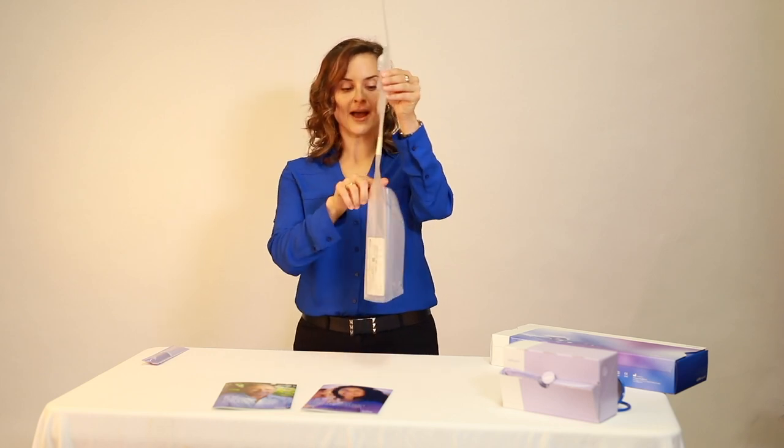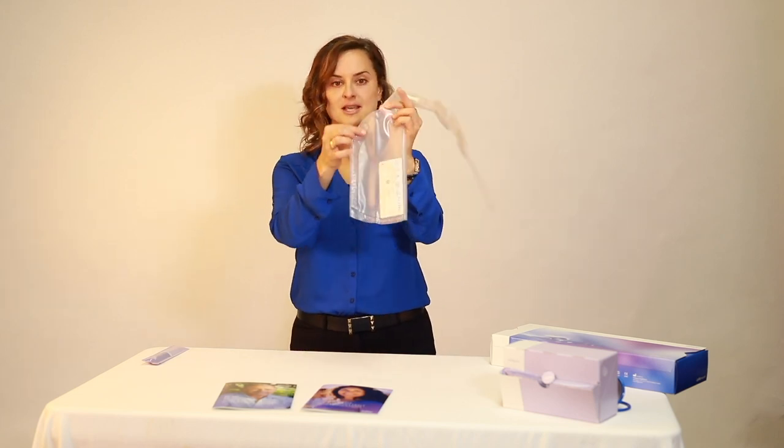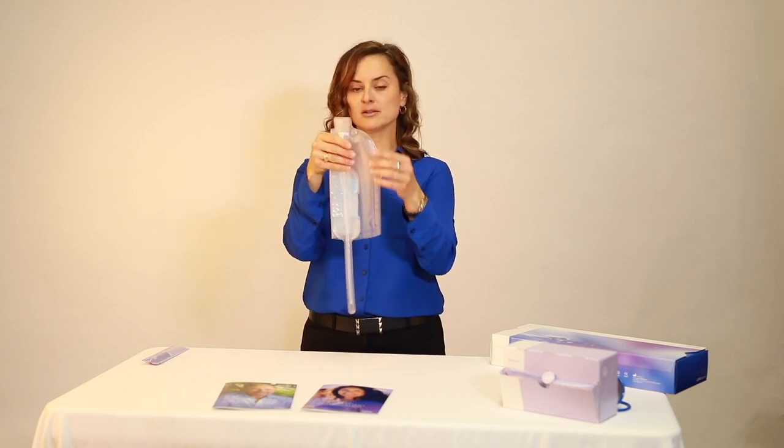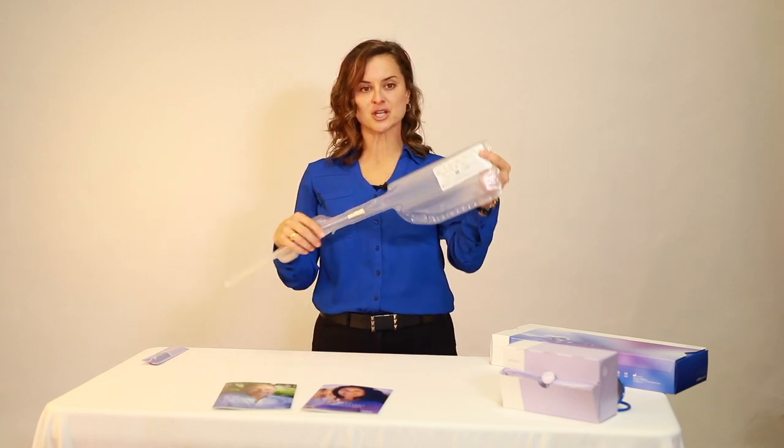The collection bag is clear and has measurements along the side, so that it's easy to assess both color and amount. The Lofric HydroKit comes in 8 inch and 16 inch, straight and coudé, in diameters ranging from 8 through 18 French.